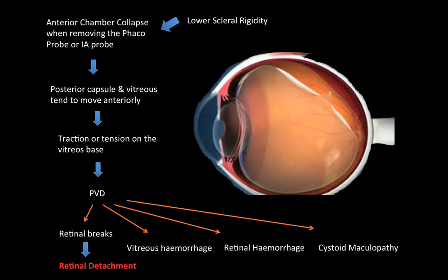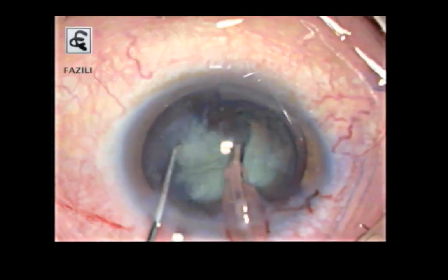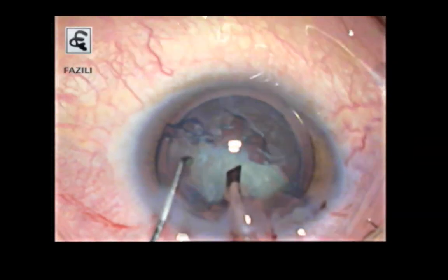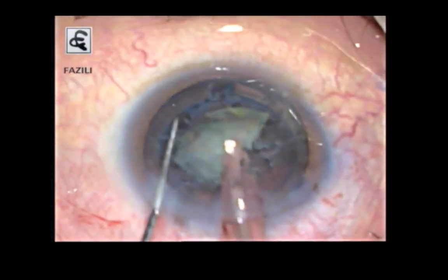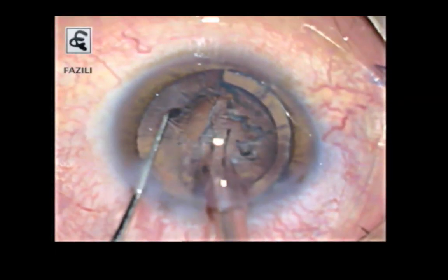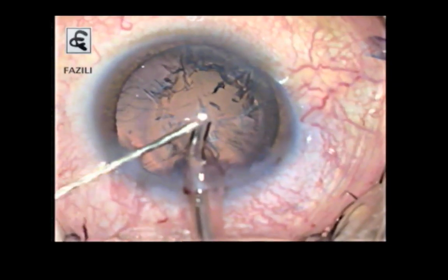So I'm going to point out certain ways by which we can avoid the collapse of the anterior chamber in myopes intraoperatively. You can see one important thing which you have to look at. In myopes, because the anterior chamber depth is bigger, there's an advantage in cataract surgery in these patients, which allows more working room during the phacoemulsification. However, the infusion pressure from the phaco handpiece can cause overinflation of the anterior chamber and a tendency to push the lens iris diaphragm back.